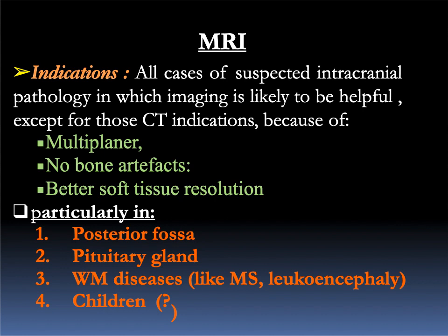MRI indication: all the cases of suspected intracranial pathology we have to do MRI, except for those CT indications.